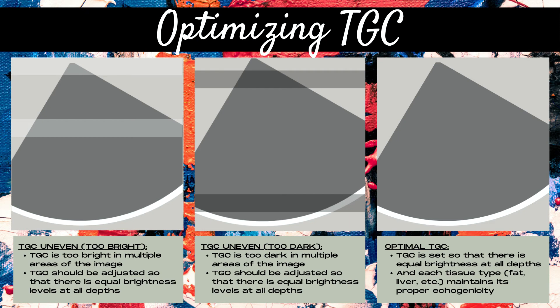The same thing can happen with the kidney. When imaging the kidney, the top part may appear brighter in echogenicity than the bottom part. You want both cortexes of the kidney to be the same brightness level, so pay attention to all aspects of the organ and ask yourself: is it the same echogenicity throughout?